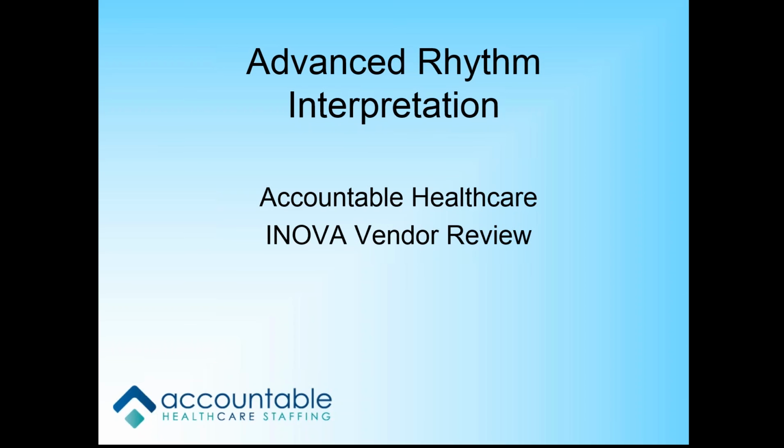I'm glad you brought that up, Crystal. One of the things to keep in mind is that we as nurses are responsible for what the teletech interprets. Let's say the teletech mounts a strip and does their interpretation, you have to sign off on it. Because at the end of the day, when you sign off at the bottom of all your charting and you're finished with that chart for the day, you're saying everything that's been entered into it is correct and that you've seen it. So even though you have a teletech, you're still the one responsible for that interpretation. The teletech would do it as an ICU nurse. Oh, okay. That works then. If the teletech is a nurse, you're good to go. Yeah, and then we were responsible for knowing the lethal rhythms, which was our main responsibility. Okay, perfect. So you were responsible for those.